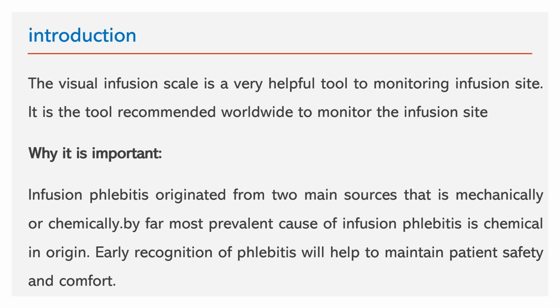As a nurse, it is very important to handle the intravenous line every day. In this video, we are going to learn in detail what the Visual Infusion Phlebitis Scale is and how it is helpful for us. It is really very helpful for nurses to understand the healthy condition of the IV line. After understanding that, we can take a decision whether to continue using or to discontinue the IV line.